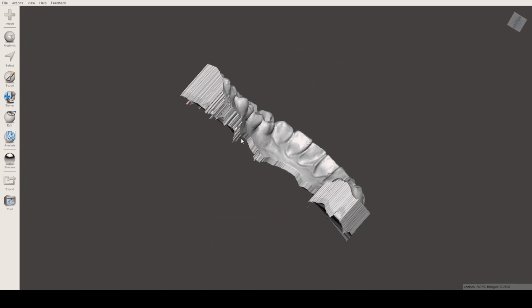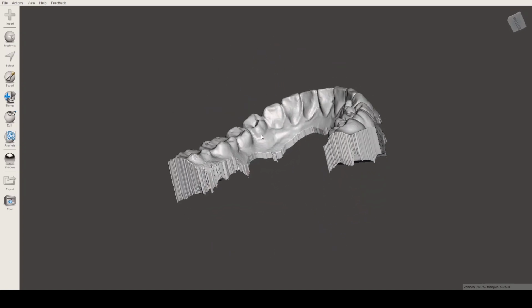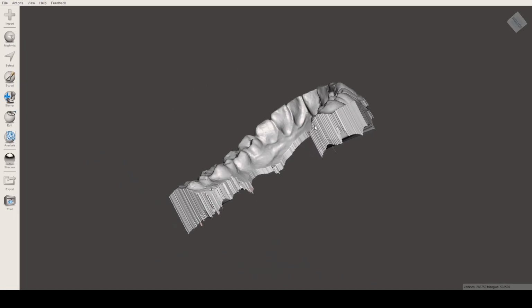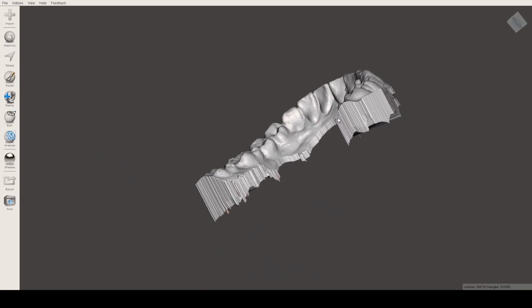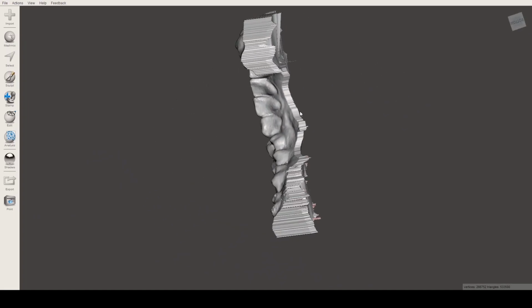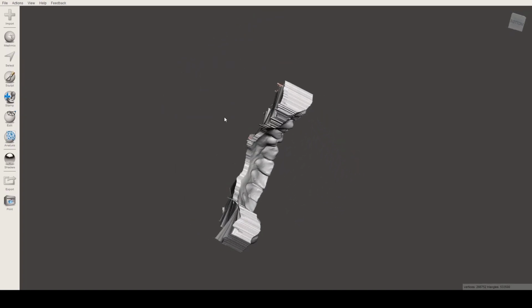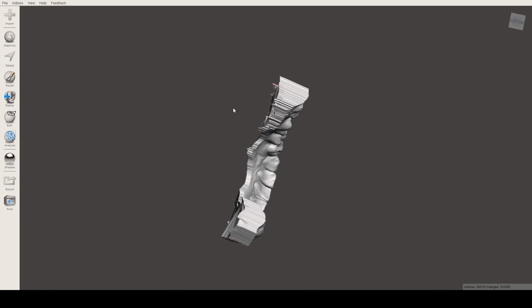As you can see, as I said earlier, right click to move around your model, or click the scroll button on your mouse. Reminder again: just get a mouse and work with 3D models, because a trackpad is going to give you a hard time.